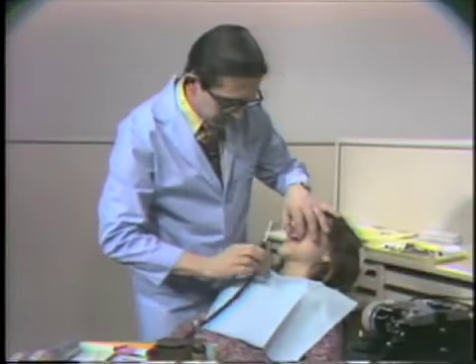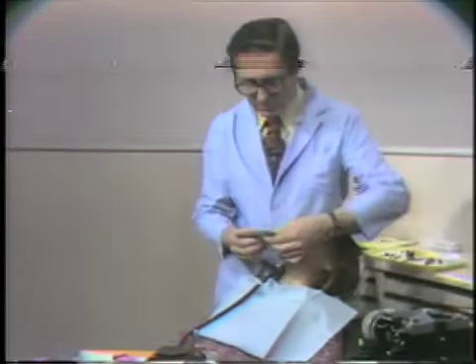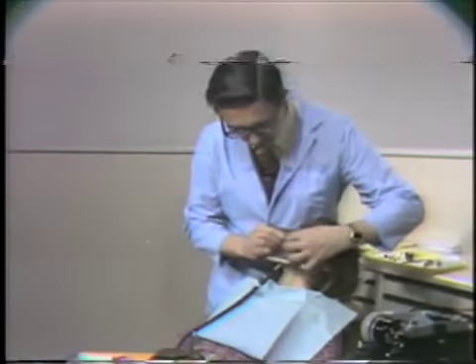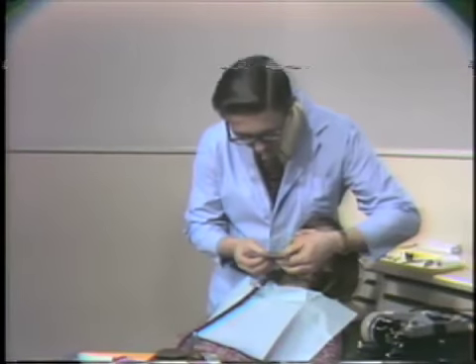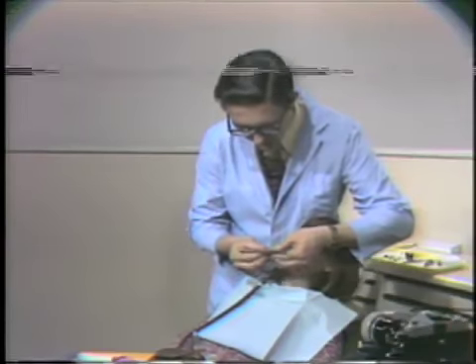Okay, let's give you a slide ejector here and have you stay open. That's just fine. Next, we're going to apply the rubber dam. First, we'll put the rubber dam over the teeth and then go through the ligation procedure.